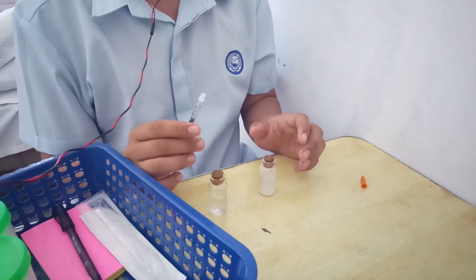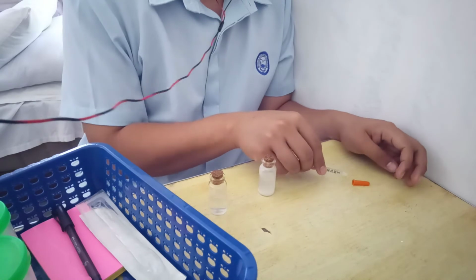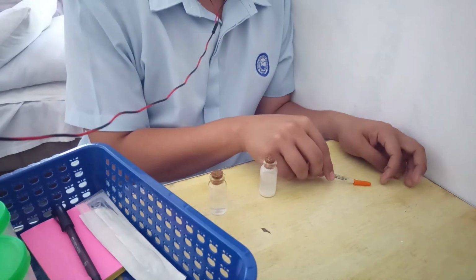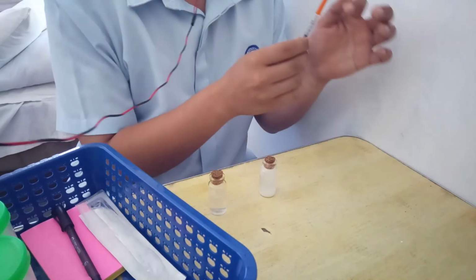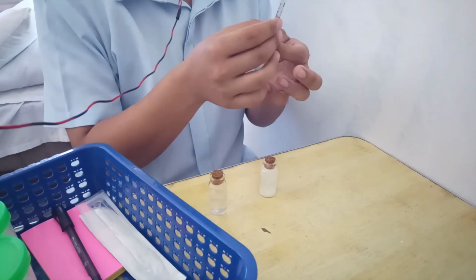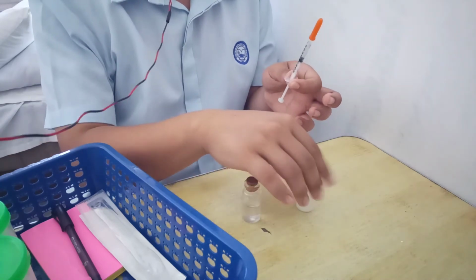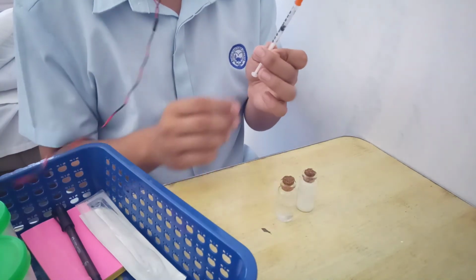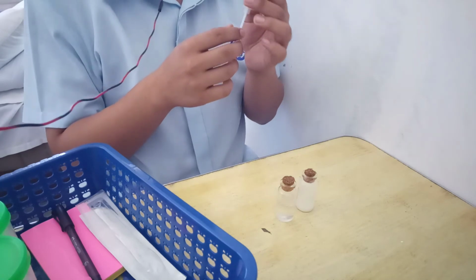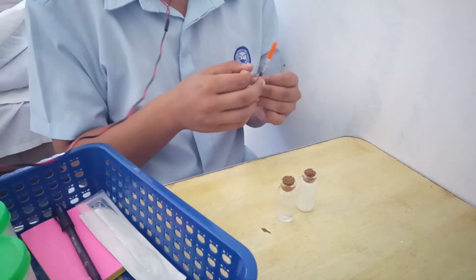We can also use the scooping method to prevent contamination. Recap, close the cap. Again, check the medication. So before, we have 10 units of cloudy and 20 units of clear, a total of 30 units. Make sure that the insulin in the syringe is 30 units.